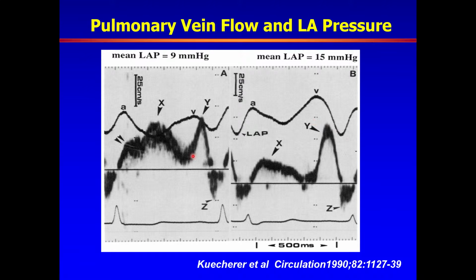Point of caution, these were patients with cardiac disease. They were going for surgery. So a similar pattern to the one that you see here can be seen in normal young individuals, though.